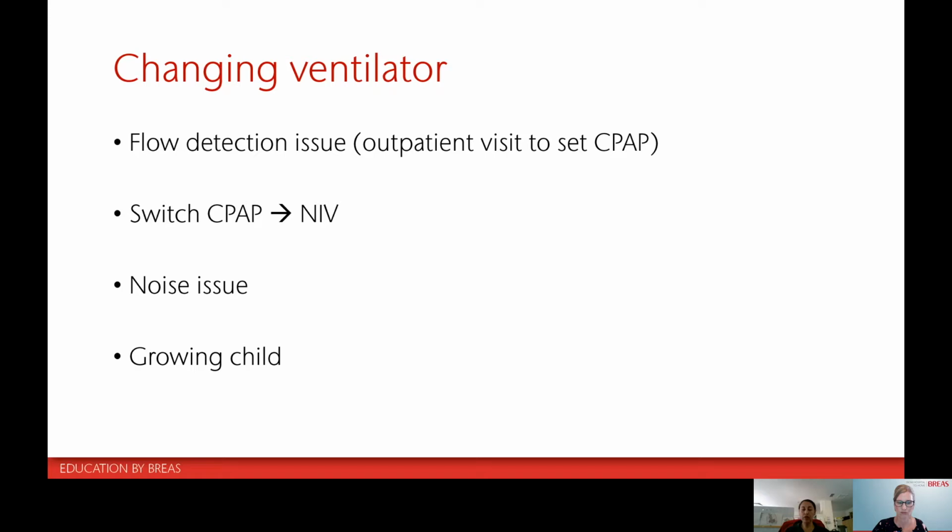Usually we won't talk a lot about monitoring, but we always do a capnography so we can see concerning gas exchange if it's okay or not. But what we like to do, because we are seeing the children during outpatient visits, is to have a look at the inbuilt software data and at the flow curves and the pressure curves. If you want to be able to follow the child correctly, for example, if the capnography was not perfect and you don't understand if you still have some obstructive events, you will be happy to see correct flow detection.